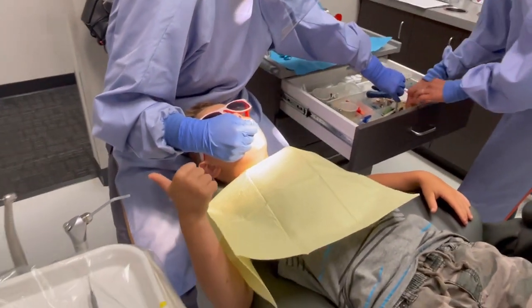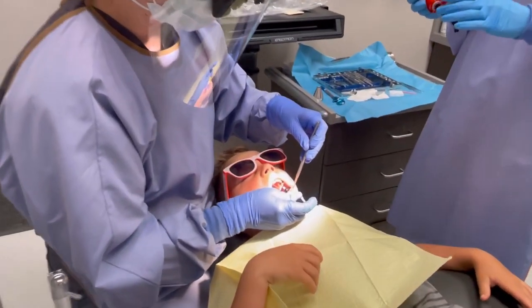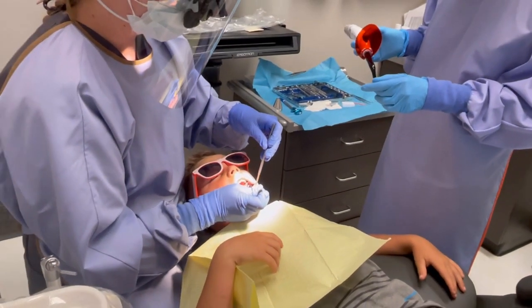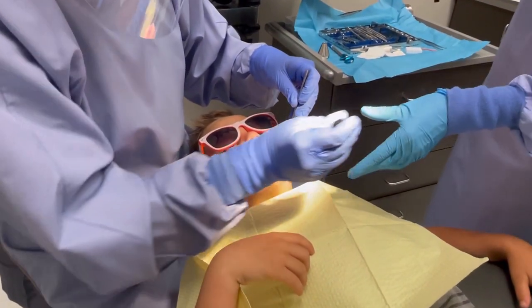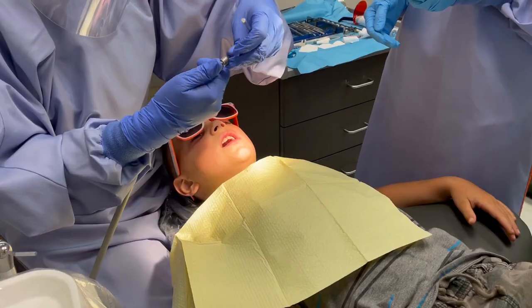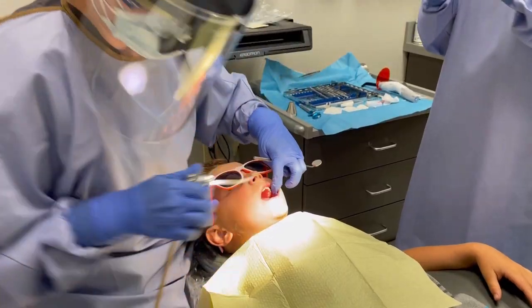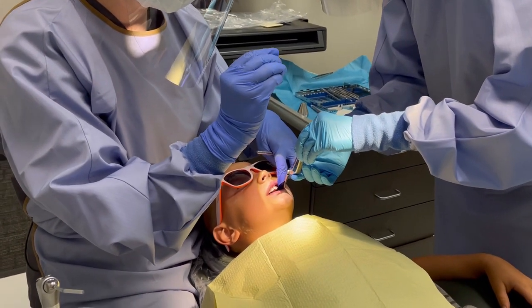Phillip, can I see a thumbs up? You're doing awesome, Phillip. I'm just going to squirt this on the tooth here. And then we're just going to shine a bright light on it. All right. Good. Mommy, you are all green! Go ahead and bite down on that paper one more time. Grind your teeth side to side, and open. And we're just going to check to make sure we can still floss through your tooth. Perfect.